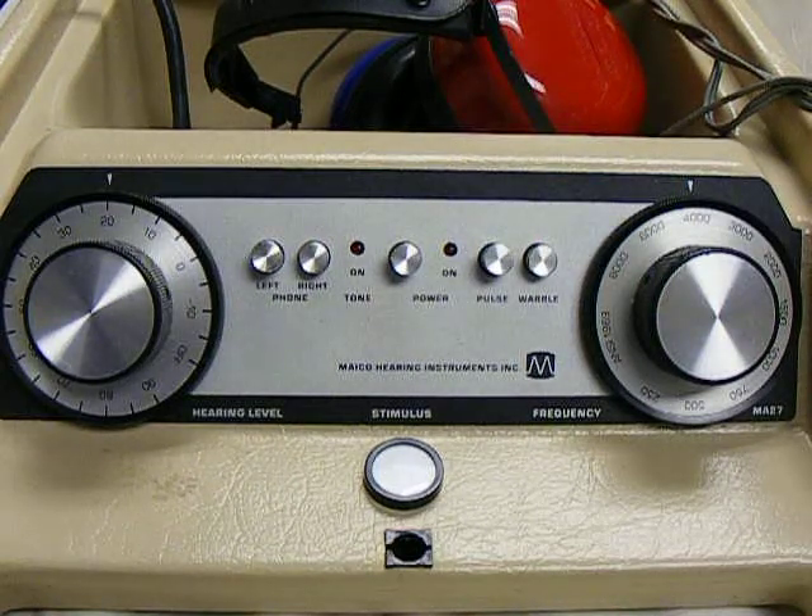Hello. This is the Maico MA27 audiometer that you might have in your clinic. I'm going to refresh you on how to use the equipment today.